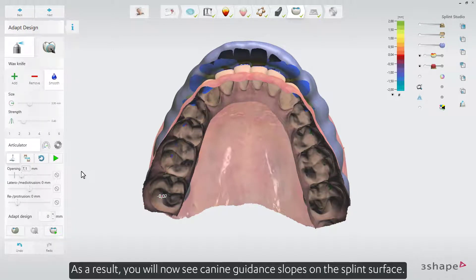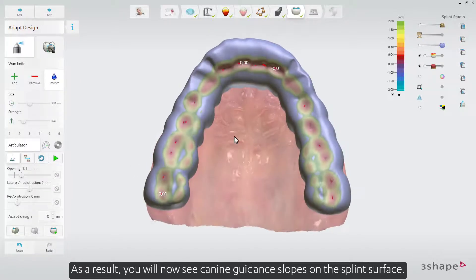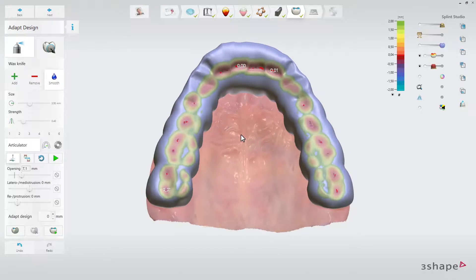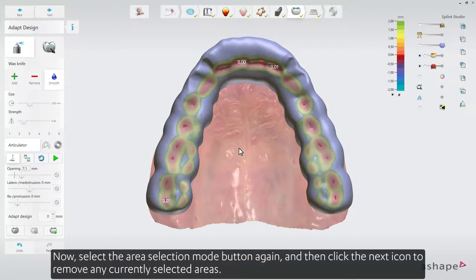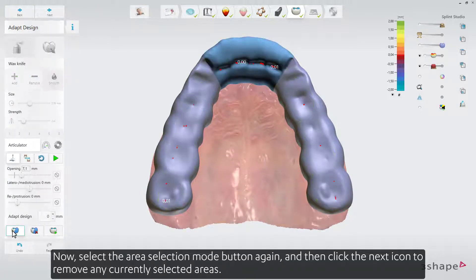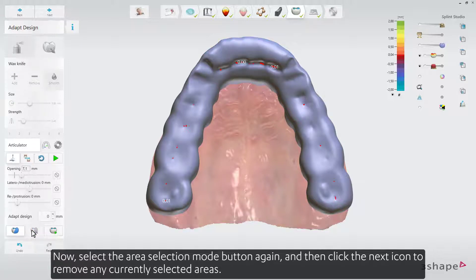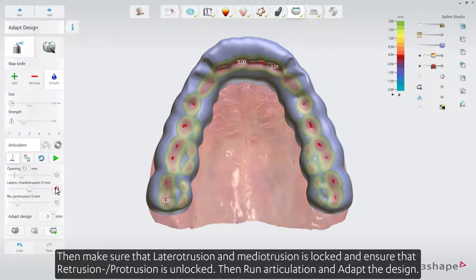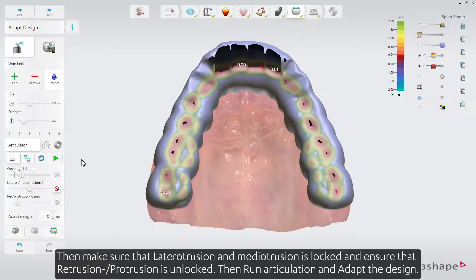As a result, you'll now see canine guidance slopes on the splint surface. Now select the Area Selection Mode button again, and then click the Next icon to remove any currently selected areas. Then make sure that Lateral-Otrusion and Medi-Otrusion is locked, and ensure that Retrusion-Protrusion is unlocked. Then run Articulation and adapt the design.